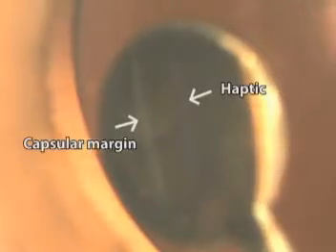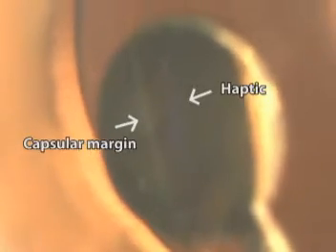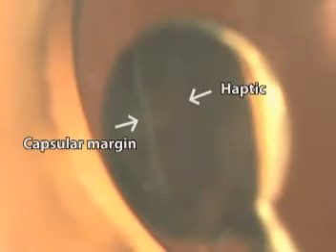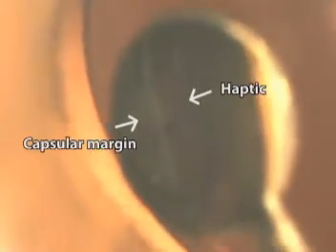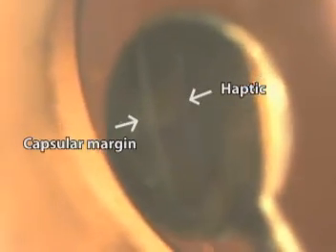The video shows that a blue haptic, which is outside the capsular bag, is well visualized. This is another case that shows a haptic inside the capsular bag.